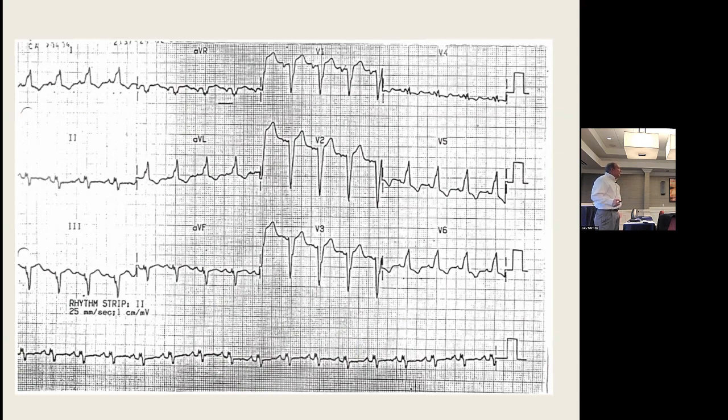I don't want to say no, because if you depolarize abnormally, you repolarize abnormally. And remember, there's a lot of heterogeneity. Where's the defect? It may not be clear. Here's the way the EKG goes. You always call the worst case scenario, and then everything else could be below that. So if you think it's ischemia, I would not fault you for saying this was lateral ischemia, but you also have to identify that the patient has left bundle branch block with probable repolarization abnormality.